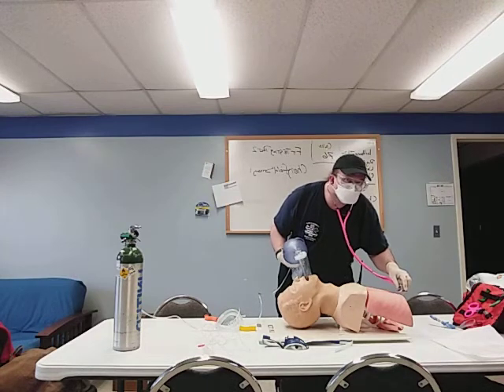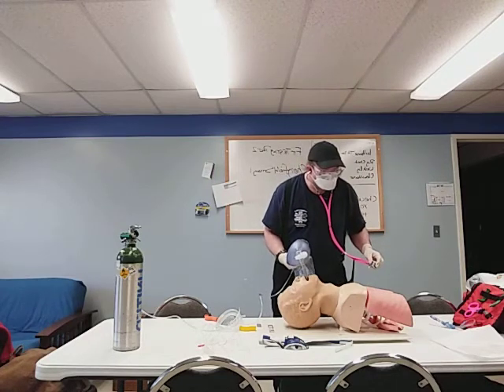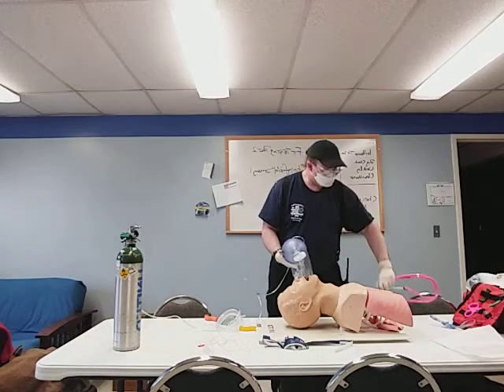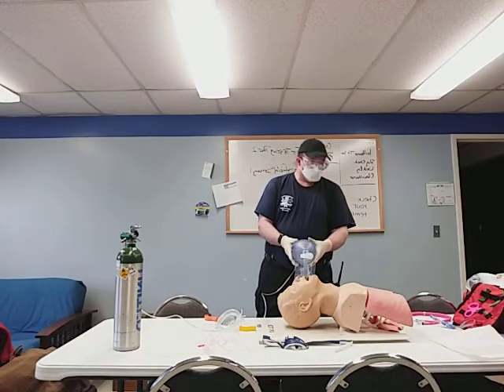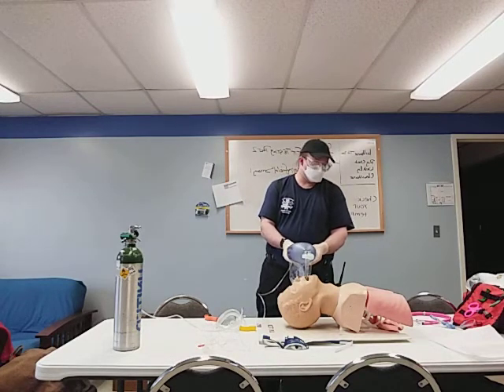This is where I would verify there's no sounds of air going into the GI. I do not feel that any adjustment is necessary.